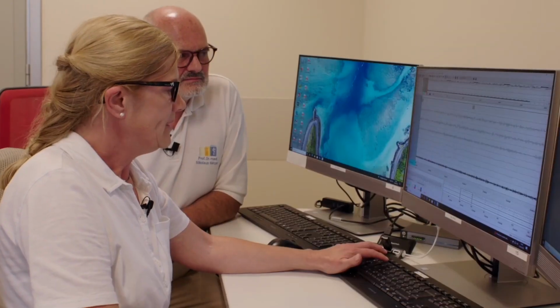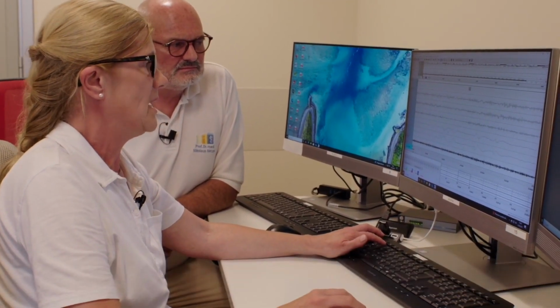Here we have the awake stage. This means we have beta waves of 13 hertz or more. We evaluate this in 30-second intervals as required by the AASM, and now we'll see what the patient is doing.